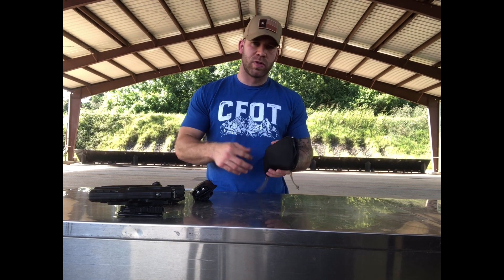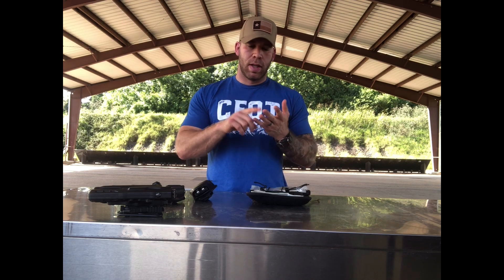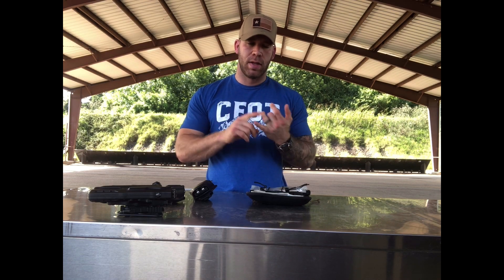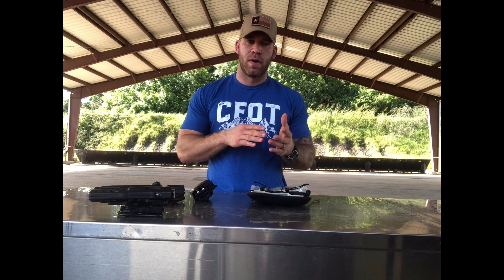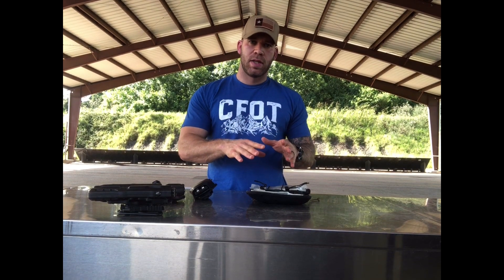From a first responder perspective, what we teach police officers is that the two main things we want to treat are stopping the bleeding and clearing the airway. Later we focus on tension pneumothorax and hypothermia. Ideally during those circumstances there's already a medical professional on scene to take over treatment. So what we're focused on in this kit is stopping the bleeding and clearing the airway.